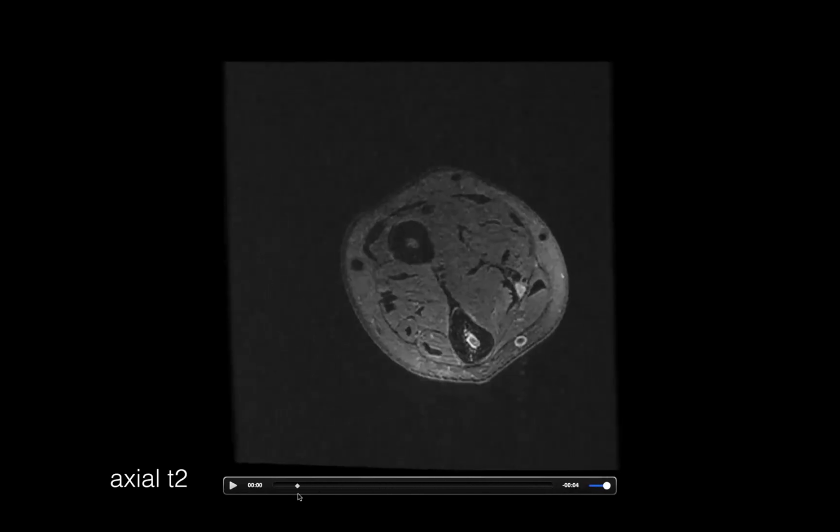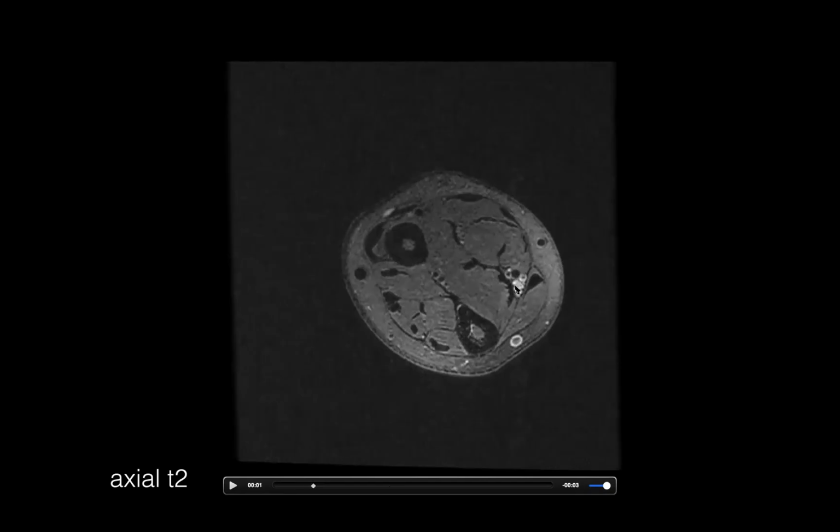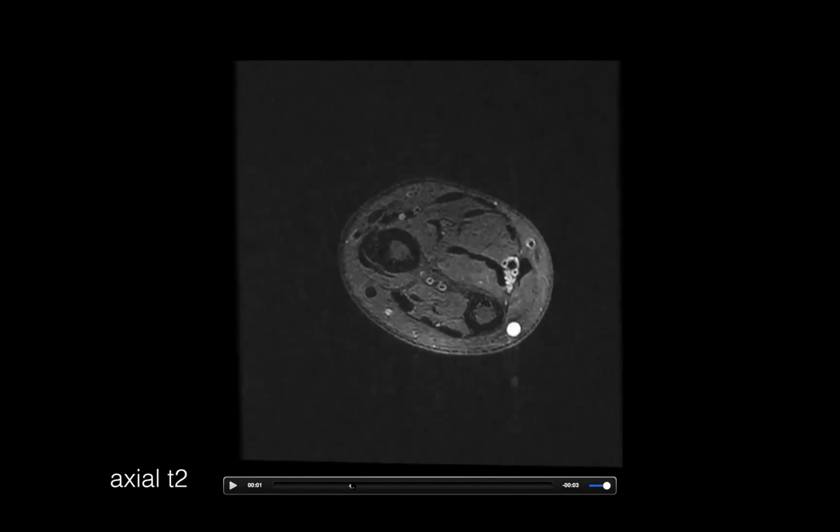So for instance here, the center is the artery, that one. On each side, there's a vein. So usually the veins in the arm and the legs, at this level, will go in pairs around the arteries. And then this looks nothing like a vessel. That just has the look of a nerve. And in fact, it has all the little fascicles of a nerve. So on this sequence, I tell by the look.